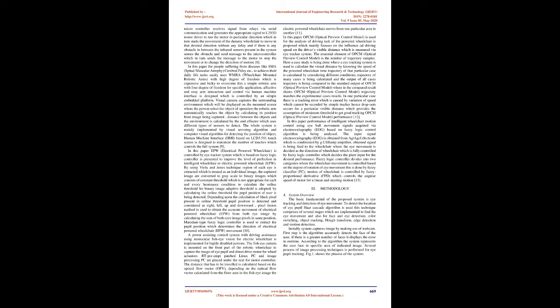And if there is any obstacle in between, the infrared sensors present in the system sense the obstacle and send a message to the microcontroller, which in turn sends the message to the motor to stop the movement or to change the direction of motion.